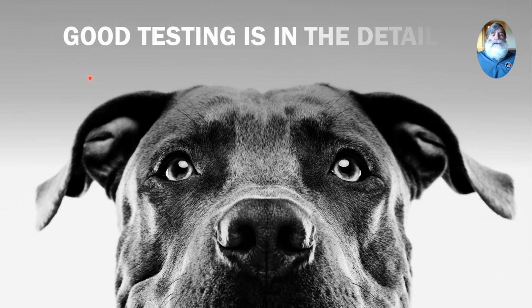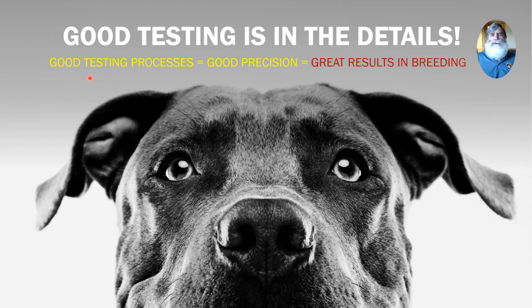All right, so you can see with all the different sections and areas that will affect your precision, it's really important to consider the details. So good testing is really in the details. Good testing processes, pipetting, mixing, blood drawing, temperature in the room, and all the other things that we talked about earlier will give you good precision. That means tight. That means the numbers will be tight between the mean and the high and the low. And then give you a much better way to interpret your numbers for breeding.